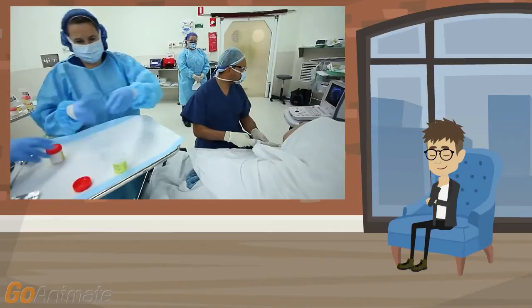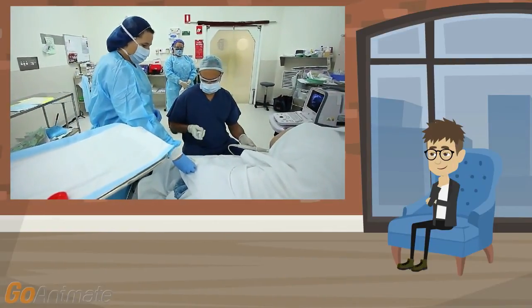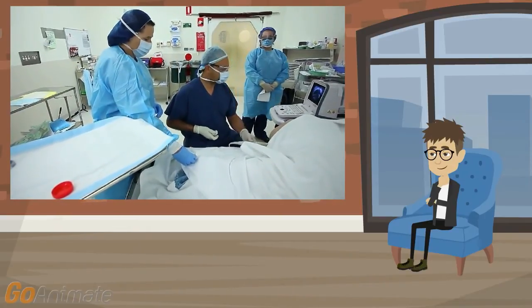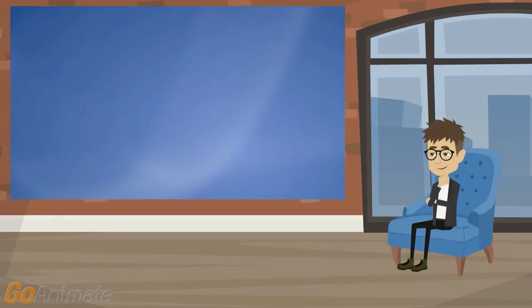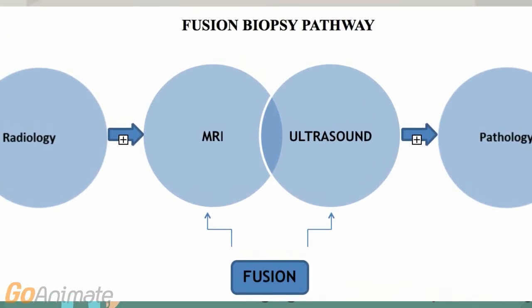It's also important to emphasise that I take finger-guided prostate biopsies of any abnormality that I can feel in your prostate. Therefore, if we feel something abnormal, we specifically target it. And this is something that the ultrasound probe can't do. By doing this finger-guided prostate biopsy, we increase the chances of finding a prostate cancer if it's there and finding it early. In some instances, MRI TRUS fusion is used to enhance prostate depiction.